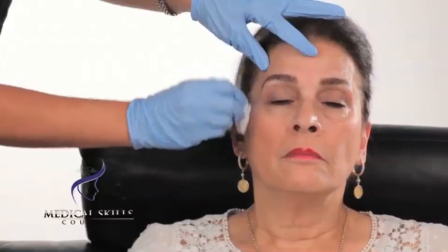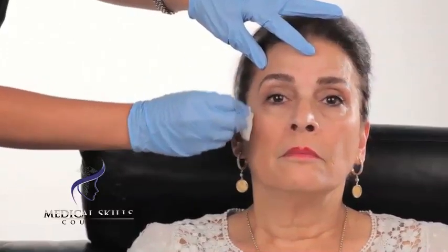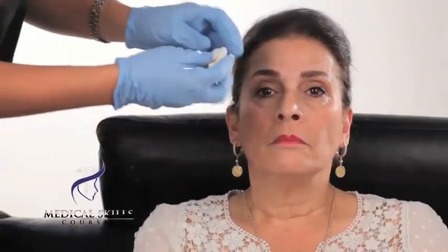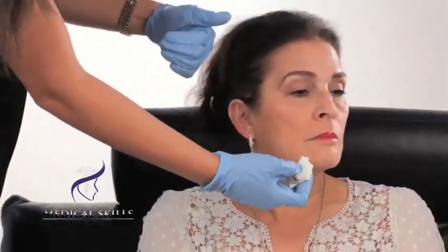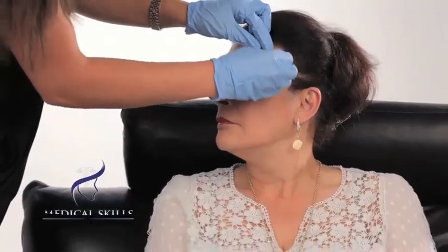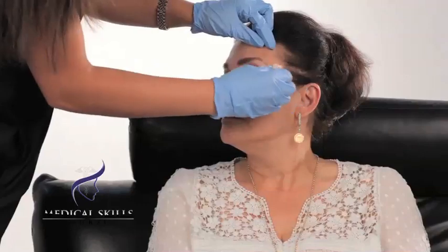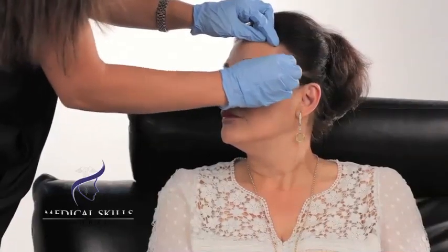It's a good idea to ask your patient to attend the appointment without any makeup on to aid this process. The face is now ready. The next part of the process is to apply local anesthetic to the areas that are being injected. This is particularly important in patients who find the injections uncomfortable or in needle-phobic patients.